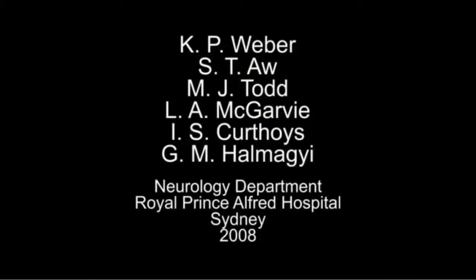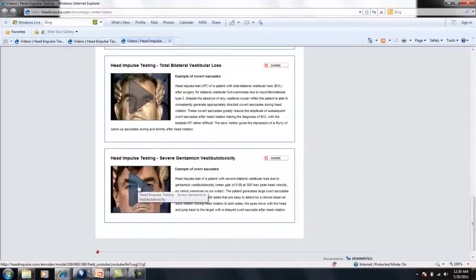Head's turned, and eye looks back. But as you see, even with the regular recording, the regular speed, an overt catch-up saccade is very easy to see with the naked eye.